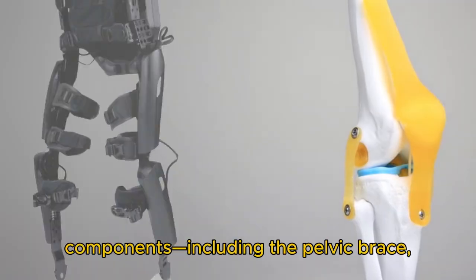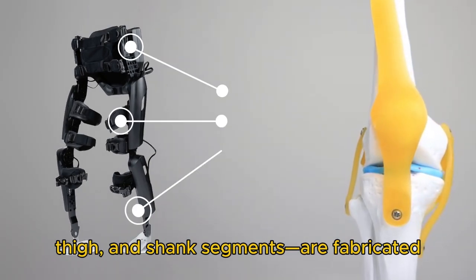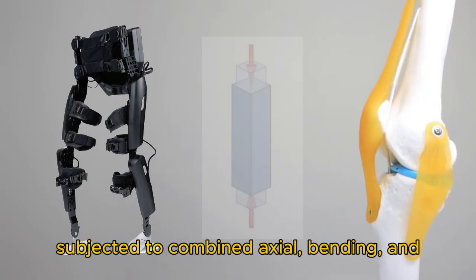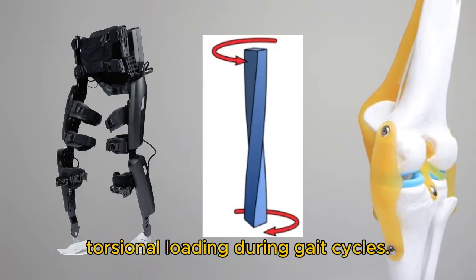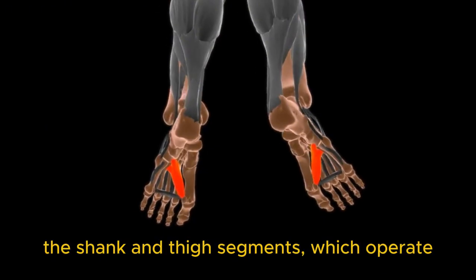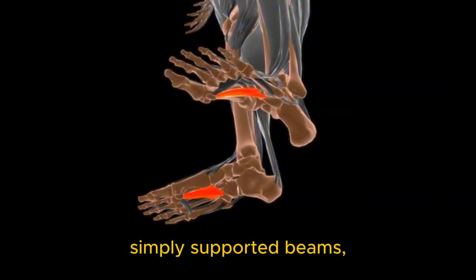The primary structural components, including the pelvic brace, thigh, and shank segments, are fabricated from 6061-T6 anodized aluminum alloy and are subjected to combined axial, bending, and torsional loading during gait cycles. Ground reaction forces encountered during heel strike and toe-off are transmitted upward through the shank and thigh segments, which operate mechanically as cantilevered or simply supported beams.